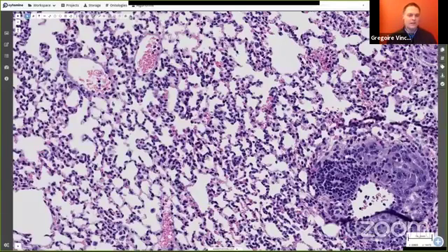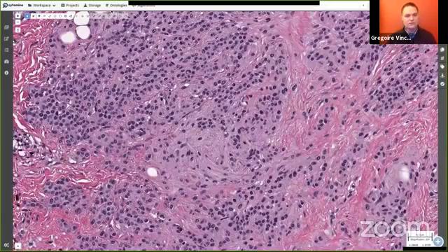Because the images that we have here are very wide, as I explained. So here is just a very small part of this image. In this image, you have to compare objects, which are cells here, organized in tissues. And the difference between a normal cell and a sick cell will be very, very thin. Sometimes there is no difference at all, and it's just a question of how it's organized in space. So you have to pay attention that your AI will fit the tissue and the disease that you wanted to see. Also regarding the coloration, because some tissues can be very different from each other regarding spatial structure and coloration.